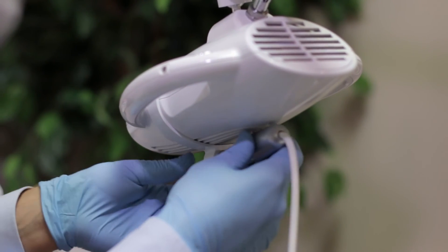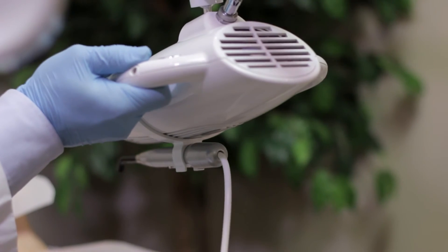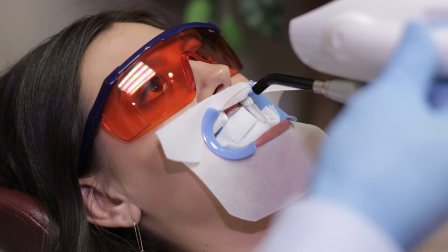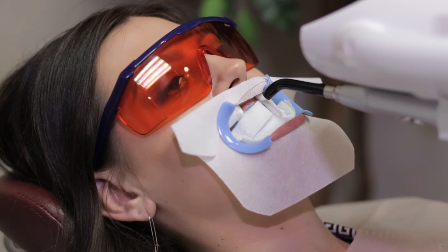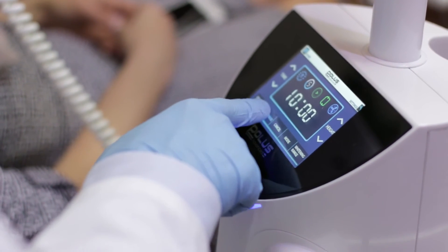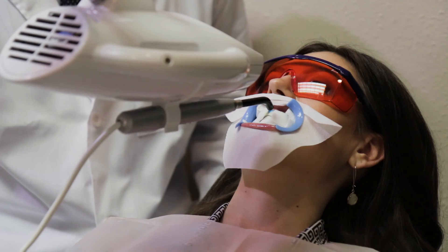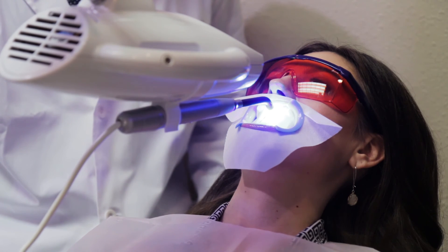Attach the lamp head holder for the spot whitening device to the bottom of the lamp head and secure the device. Position the lamp head so that the spot whitening device is at a 90 degree angle to the tooth and as close as possible to the tooth without touching the surface. The spot whitening device can also be held in place by the dentist for the duration of the treatment. Once the single spot whitening device is positioned, press the start/pause button on the TUI panel or the S button on the device to begin the first cycle.